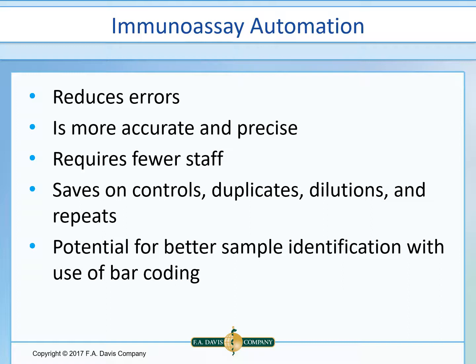We've even seen this here in our hospital where we had smaller instrumentation that we performed some of our immunoassays on that involved more manual manipulation. And these tests were added onto our larger automation, such as our Siemens Advia Centaur or Siemens Dimension Vista. The driving motivation for the development of these immunoassay analyzers has been the need to create an automated system that's capable of reducing or eliminating the many manual tasks required to perform analytical procedures.